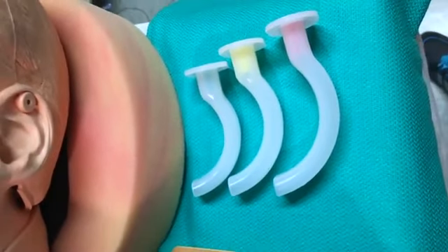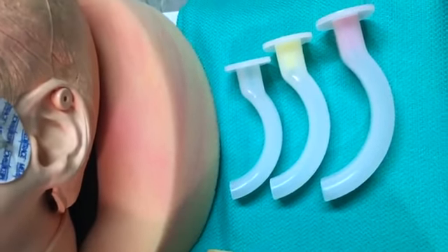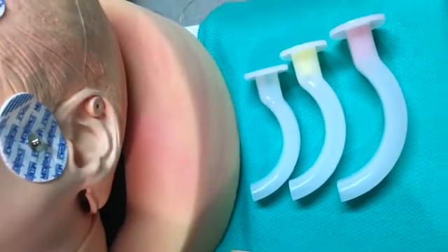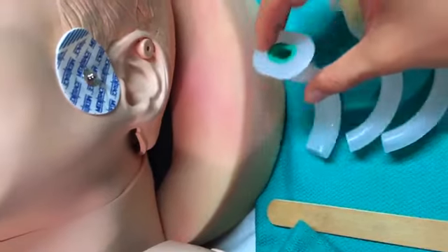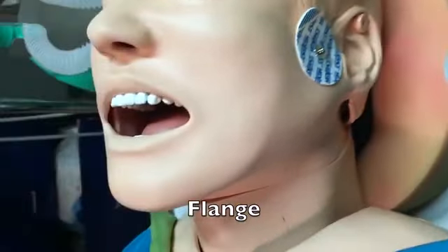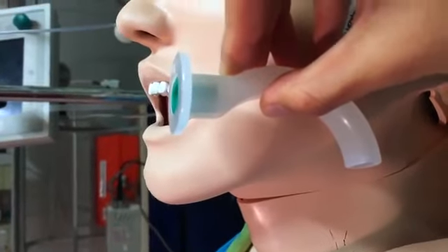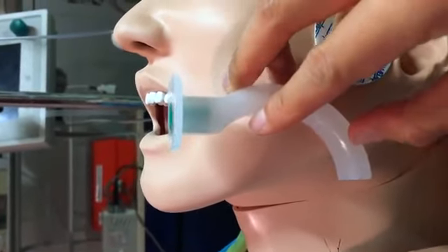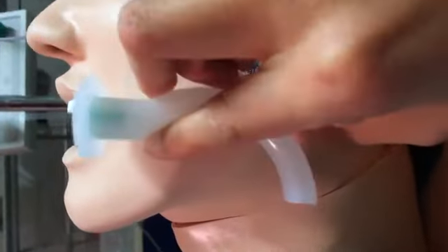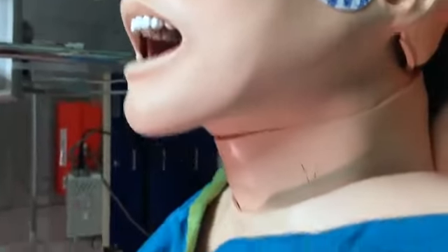So I'm going to show you the best way to figure out what size by measuring it on the mouth and the mandible. What's best is, this is called the flange. You want this at the outer border of the mouth, like here, and then you want the tip to be at the angle of the mandible but not past it. So the angle will be around here, and as you can see, this is kind of short. I'll try the red one.